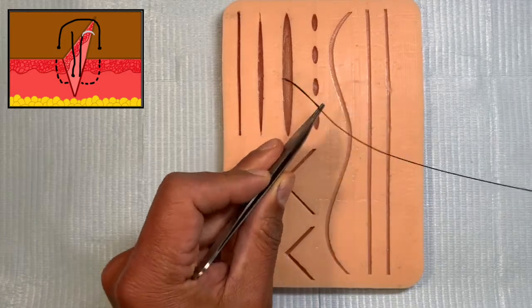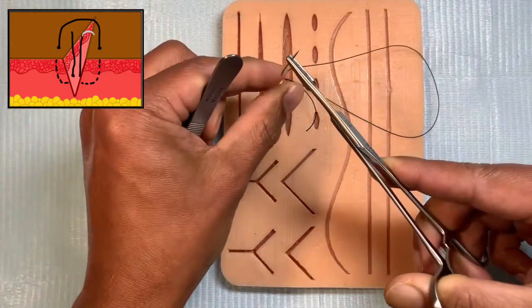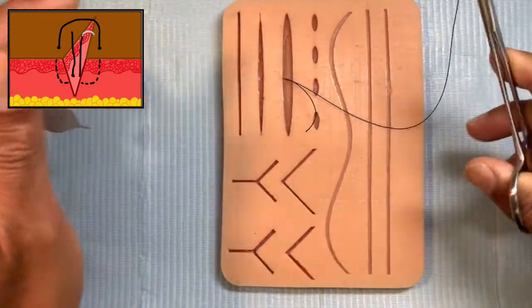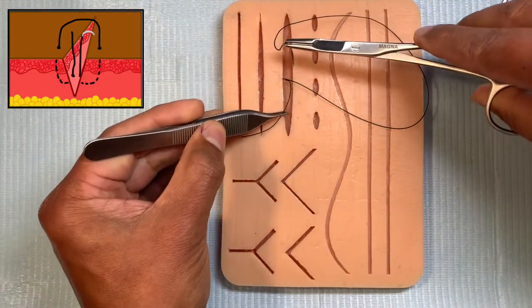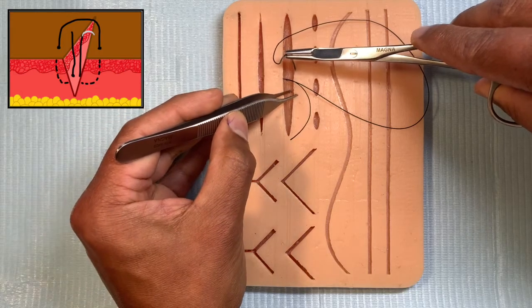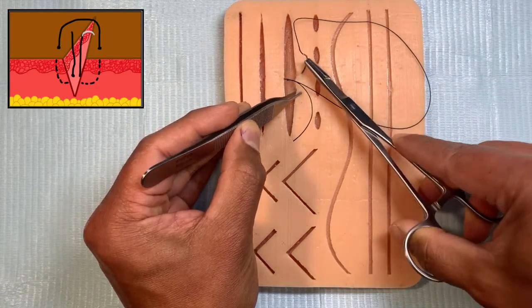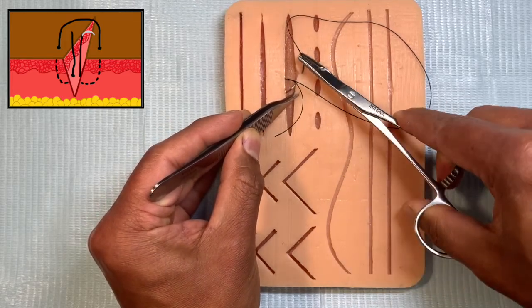So now I'm going to move this suture away from me, the small or short end, and then I'm going to hold the needle again with my needle driver. And my next bite is going to go from surface to deep. So surface to deep. So that is the S to D.